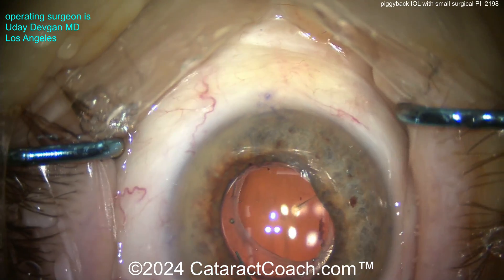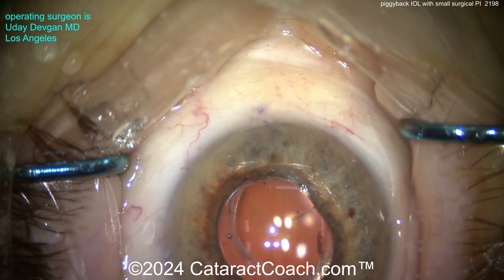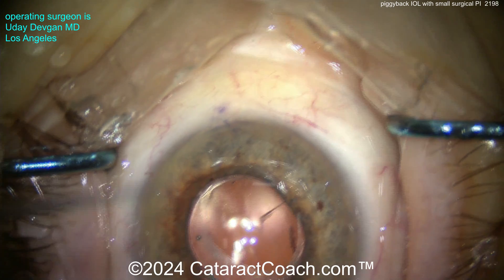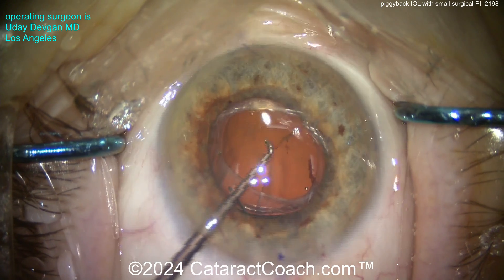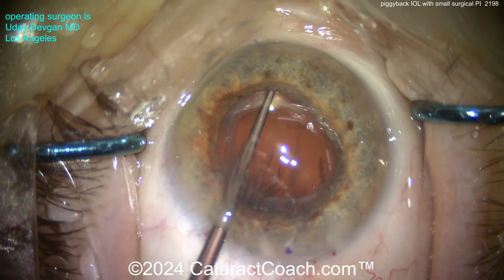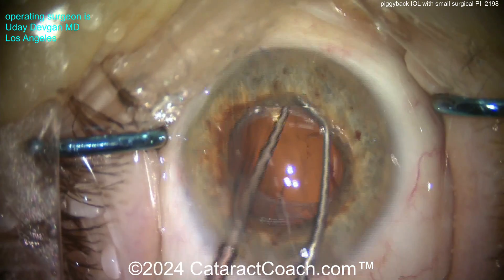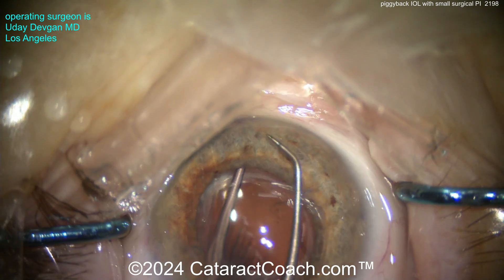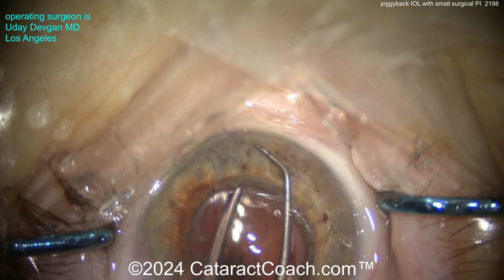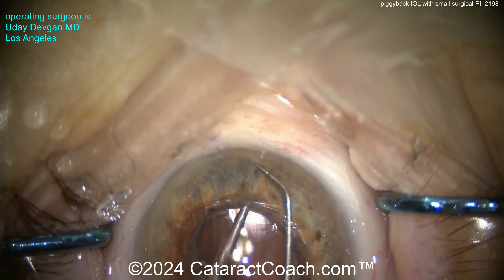Do you need a peripheral iridotomy? You probably don't — the lens is posteriorly angulated, so there's plenty of flow around it. But do you want to put one in just to be safe? If you are going to put in a PI, you don't want to make a huge one. Here's a way to make a small one: go inside with a Sinski hook upside down on the back surface of the iris, and use the chopper in the other hand — no special instruments needed.